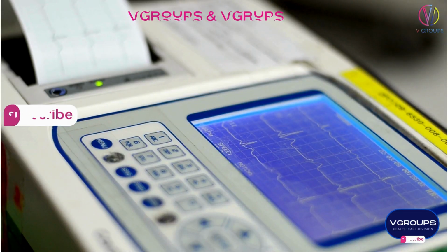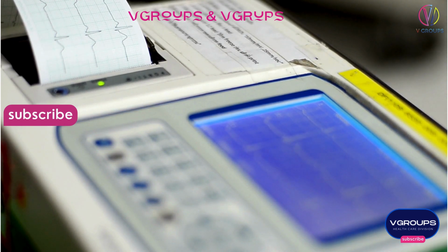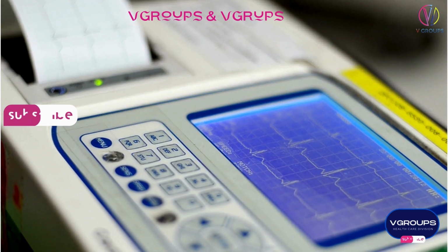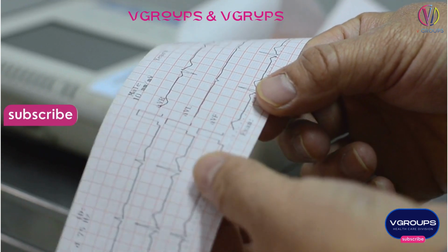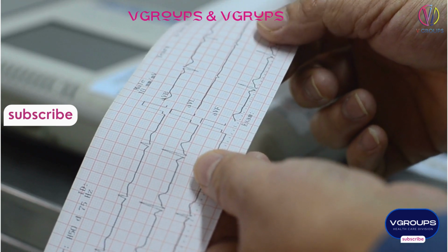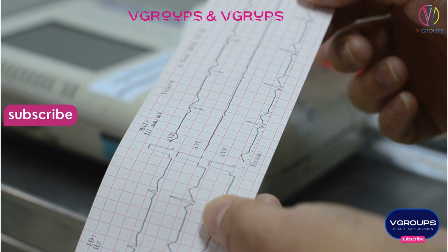An electrocardiogram, ECG or EKG, is a medical test that records the electrical activity of the heart over a period of time. The electrical impulses generated by the heart during each heartbeat are detected by electrodes placed on the skin, and the resulting data is used to analyze the heart's rhythm and function. The ECG is a valuable tool in diagnosing various heart conditions and abnormalities.